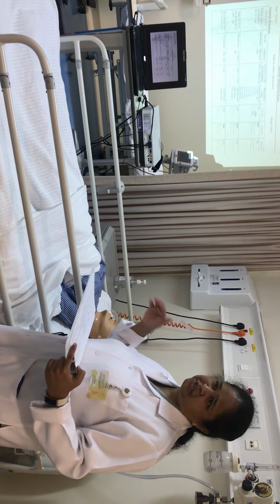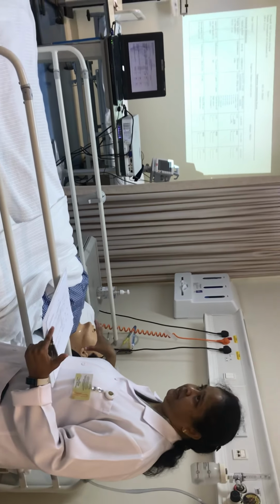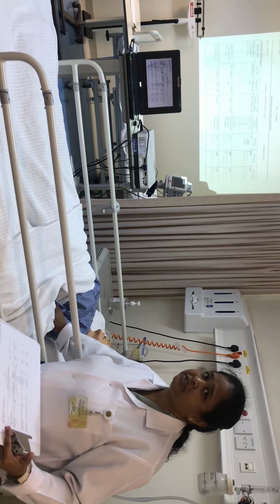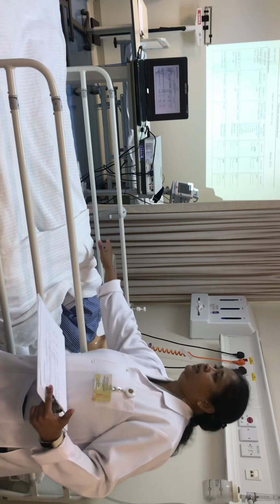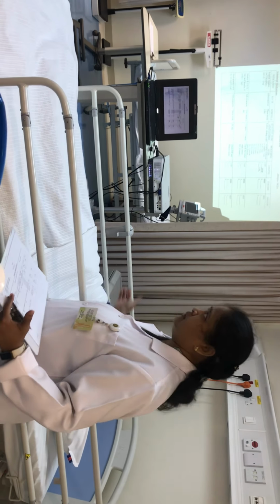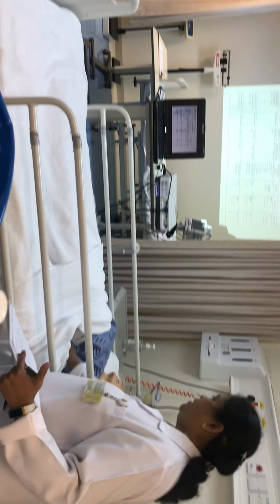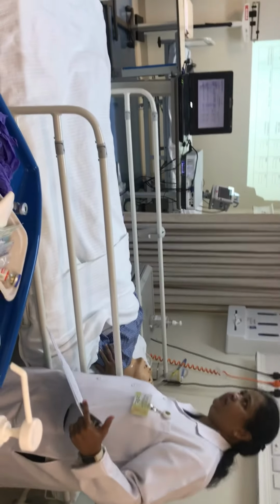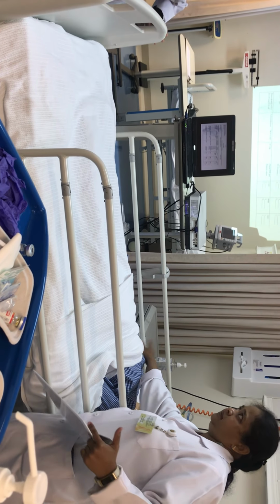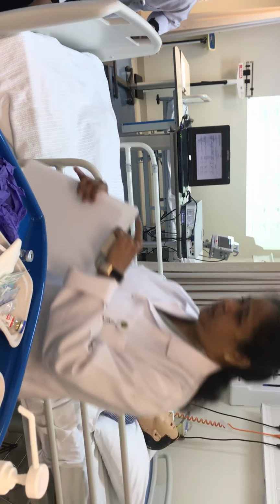I prefer to do positioning now, because once we wear gloves and when we are ready to do things, it is difficult. What position do we want? If you want to give it in the hand, put the patient in Fowler's. If you want to put it in the abdomen or thighs, the patient can be in supine. So we will go ahead with Fowler's position, because I want to put it in the arm, and my patient said they have given the last dose in the left hand and I want to give it in the right hand. Okay, patient is ready. Now I come back.